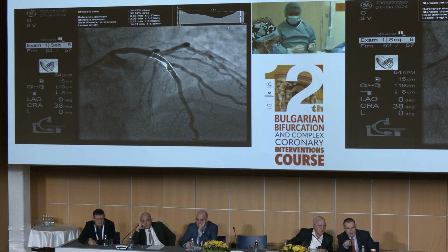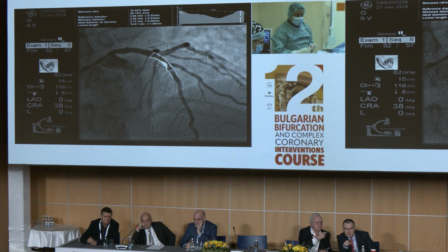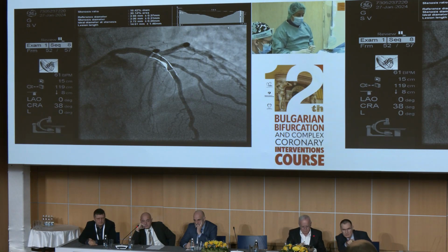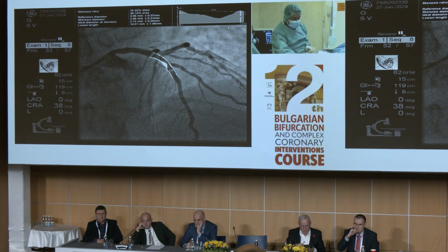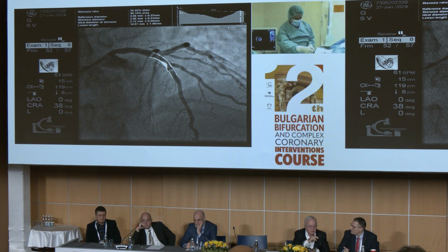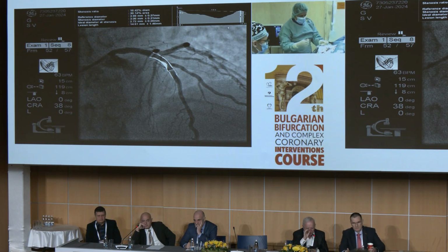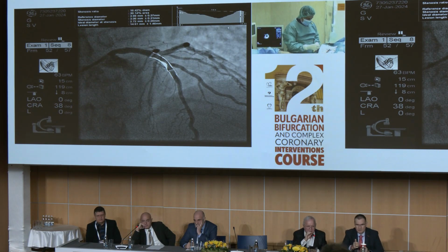In order to assess the true severity of the lesion, the true stenosis, we will need to apply bifurcation dedicated software, which is probably available in a console. So the target diameter with the stent and the balloon we choose will be to reach 3.8 millimeter.